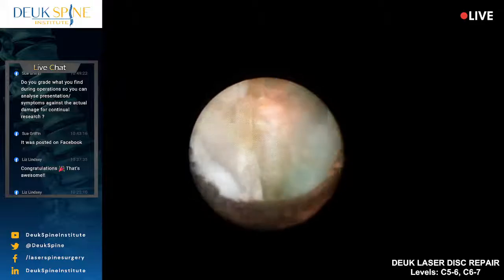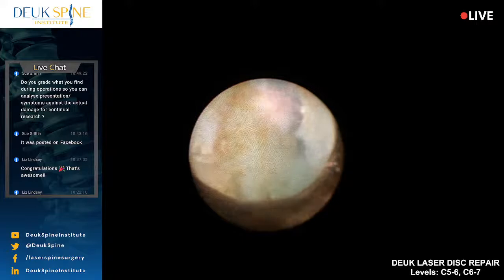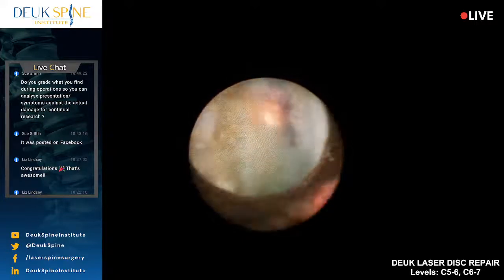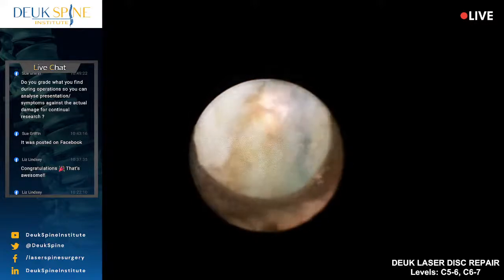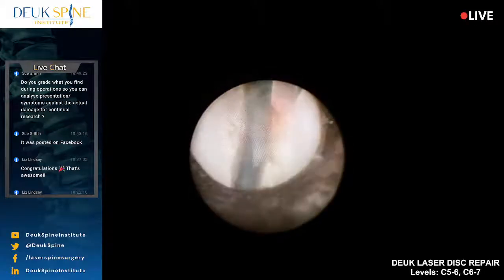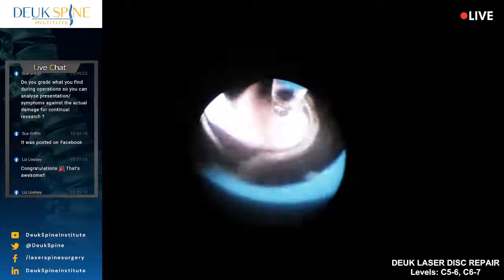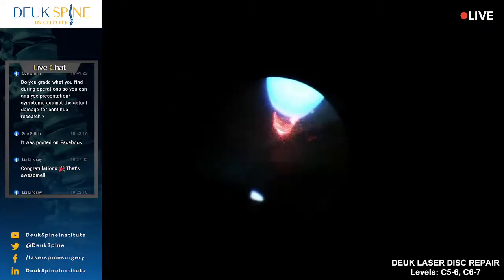This is just scar tissue on the dura. We've cleaned up 90% of it. One thing you don't want to do in spine surgeries is gild the lily. The lily is beautiful enough, you don't need to gild it. Get what needs to be done, and don't go too overboard. Going overboard only causes problems. You can get complications from going overboard. Cup off, please. Lights on, please.